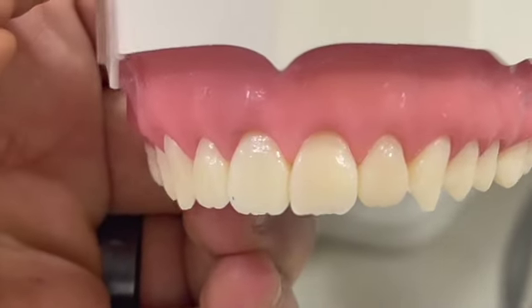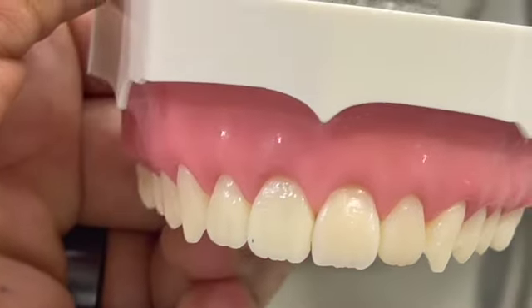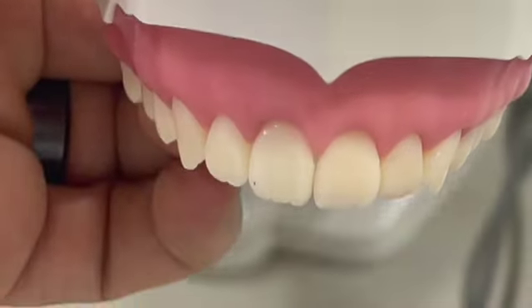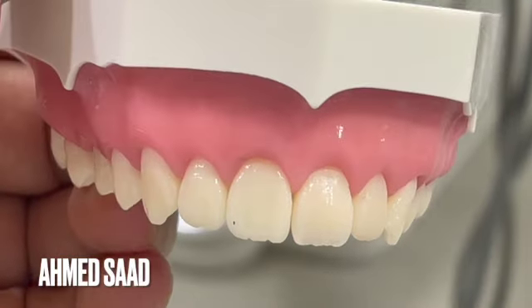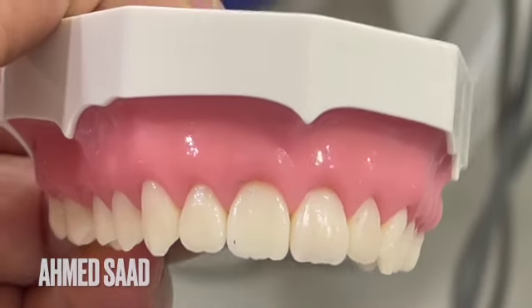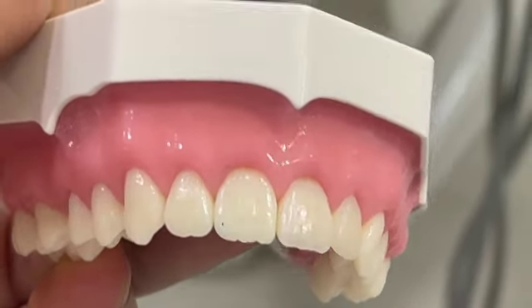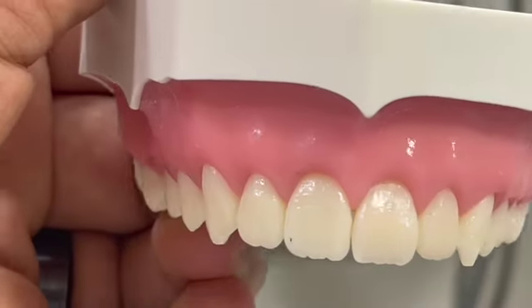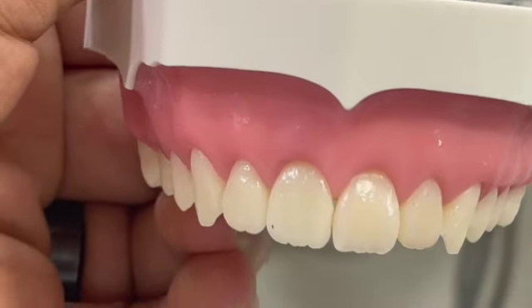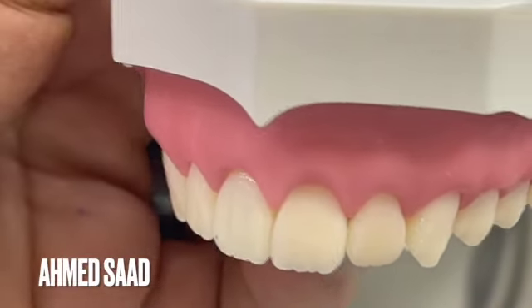Hello everyone, welcome to the first episode of class 4 demonstration. As you can see, this is class 4 composite restorations in the left central incisors. Let me show how we did that.